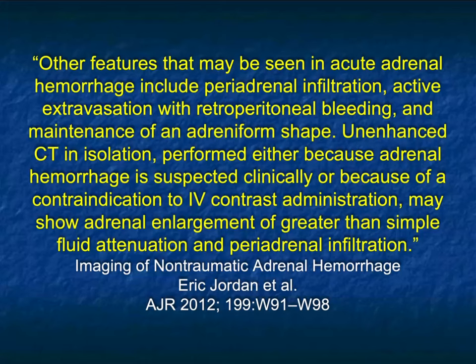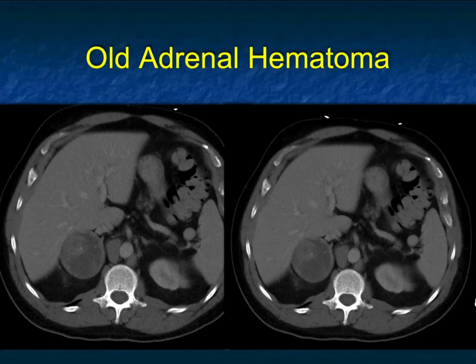The first case showed periadrenal infiltration, which is common. In the last case, the adrenal shape was maintained but with high density — so there is a spectrum. When you see a lot of changes around the gland, it means the capsule has typically disrupted, the bleed is more extensive, and the patient typically presents with more acute symptoms.